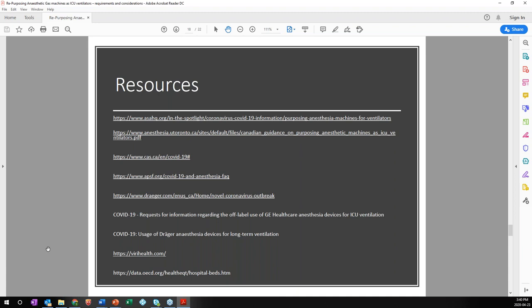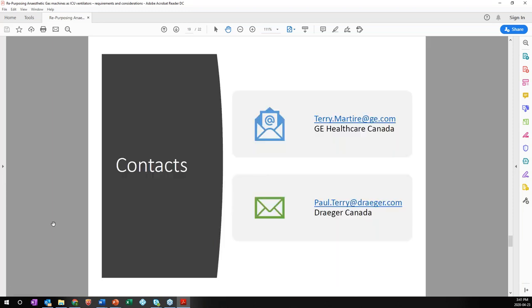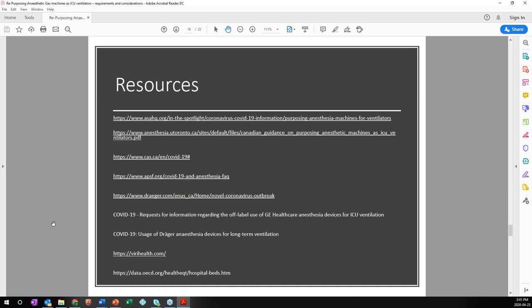The only thing I think I didn't really talk about was human resources and who should be doing this. I thought that might be an opportunity to have an open discussion. Respiratory therapists are very tech savvy, and you're very capable of ventilating any patient. The question becomes: during a crisis, is this the time to bring in a technology that you're not familiar with, that has such a different workflow around it, and a lot of different features that you haven't been specifically trained on or use in your daily practice?